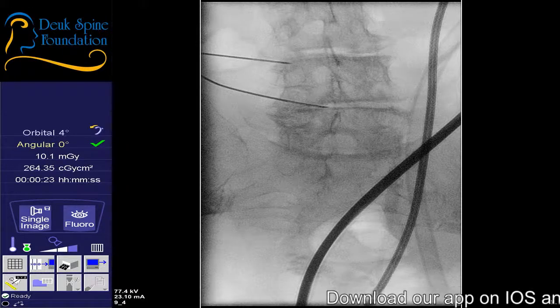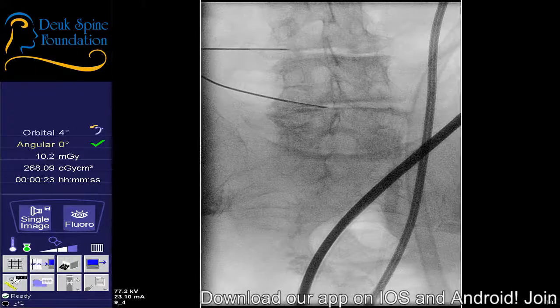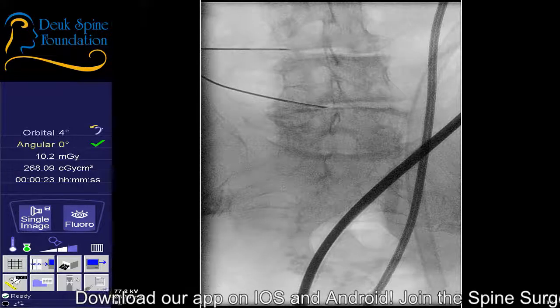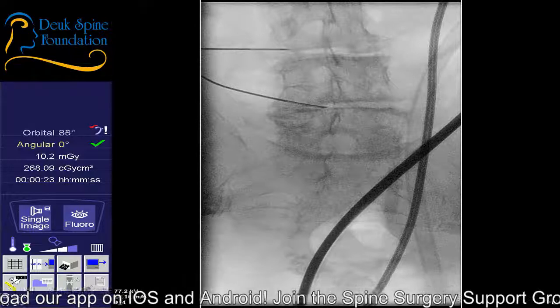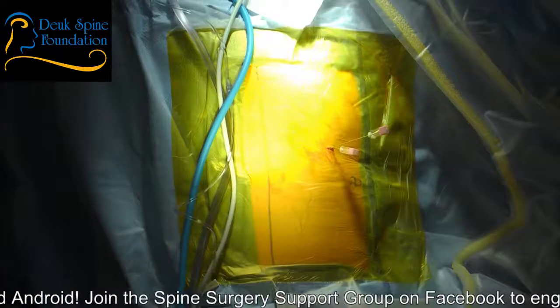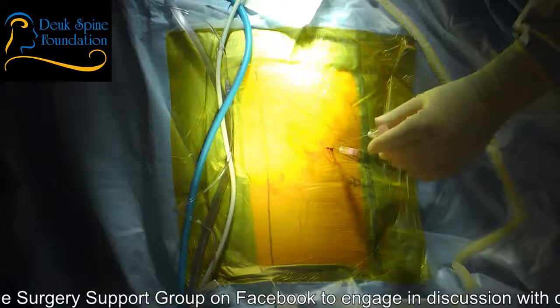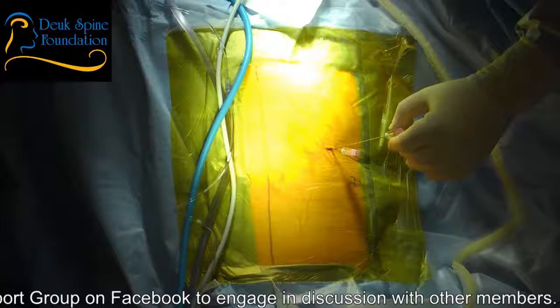Are you awake? Shot. All right, so on the AP, we're close to where we need to be, but let's see where we are on the lateral. I suspect we're not going to be where we need to be on the lateral view. We're going to have to make an adjustment. I think I'm too posterior. Yep, too posterior. It's always better to be too posterior than too anterior. Too posterior is safe. Too anterior is not good. And we're not too anterior.